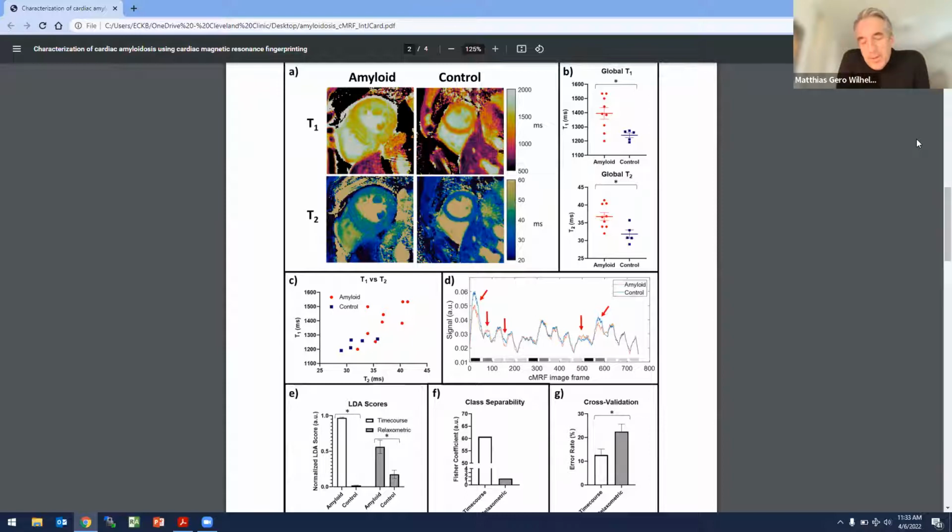Just a very small question. I think some of your patients had a pulse trigger. Now, typically, we are very concerned about the pulse trigger when it comes to mapping. So you were not concerned, or what do you think could have been the impact of that?